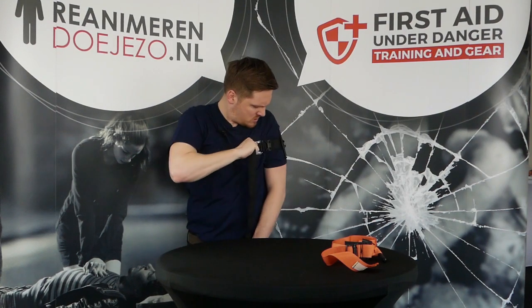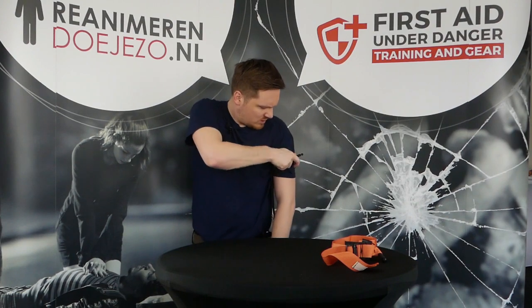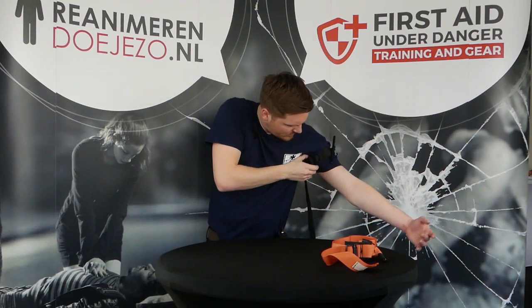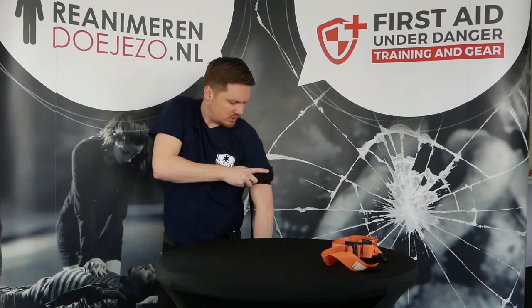And I believe now you have, but the problem is if I do it like this, I first need to pull it this way in order for me to do it like this. What I see most people do if they use this tourniquet, because I see a lot of those movies, is they do it almost like this. And if you do it like this, it's much easier. But I don't believe that people are willing to just wiggle around their arm if it's only attached to them with one fiber. So people will tend to keep it as low as possible, and then it's still quite hard to operate this tourniquet.